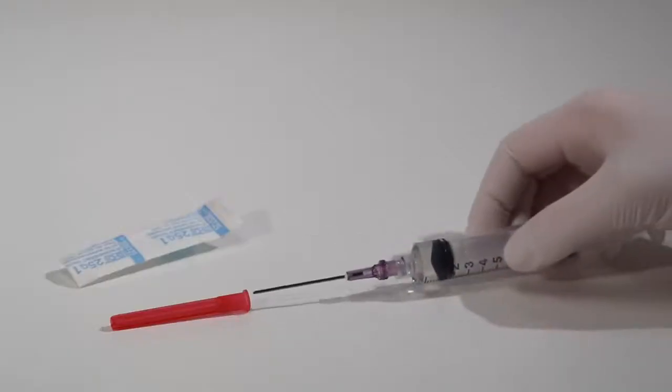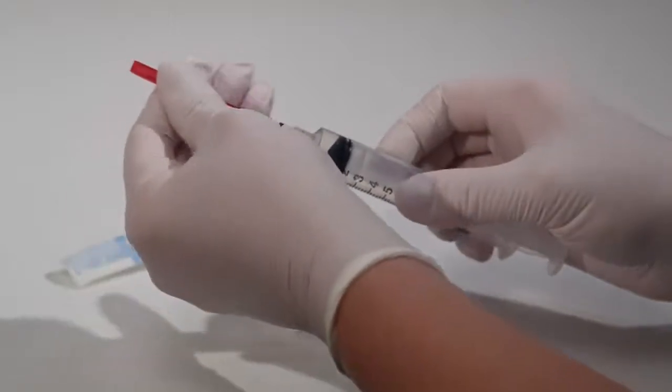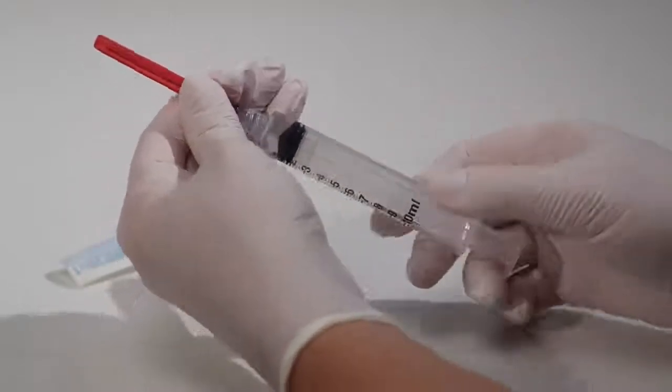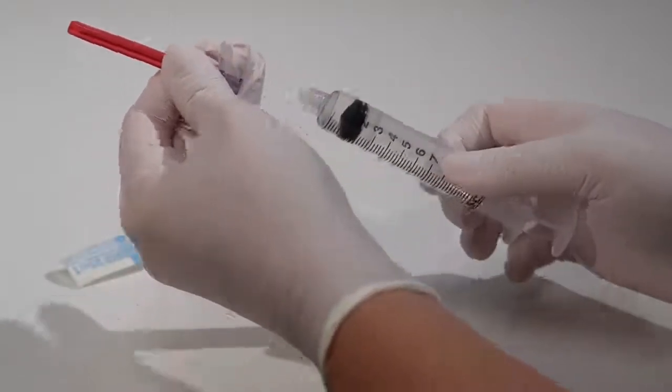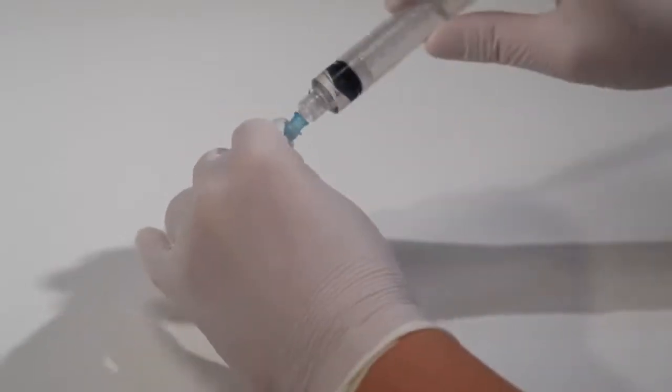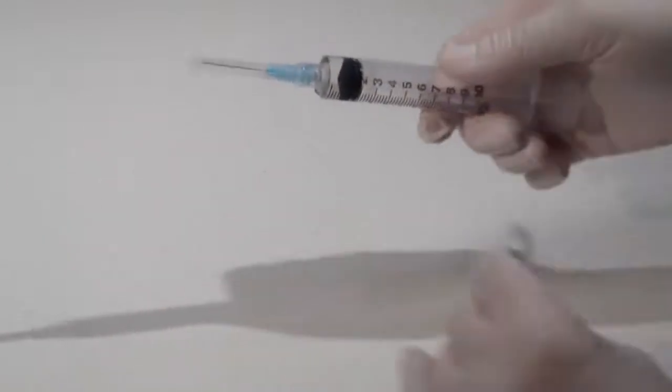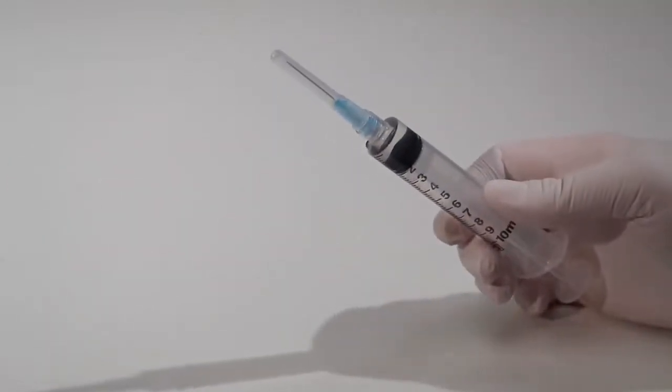Passively recap the blunt filter needle. Then, remove it from the syringe and dispose of it properly in an approved sharps collector. If performing a skin injection, attach the appropriate safety-engineered hypodermic needle, such as the BD Eclipse needle, or administer the medication directly through a vascular access device.